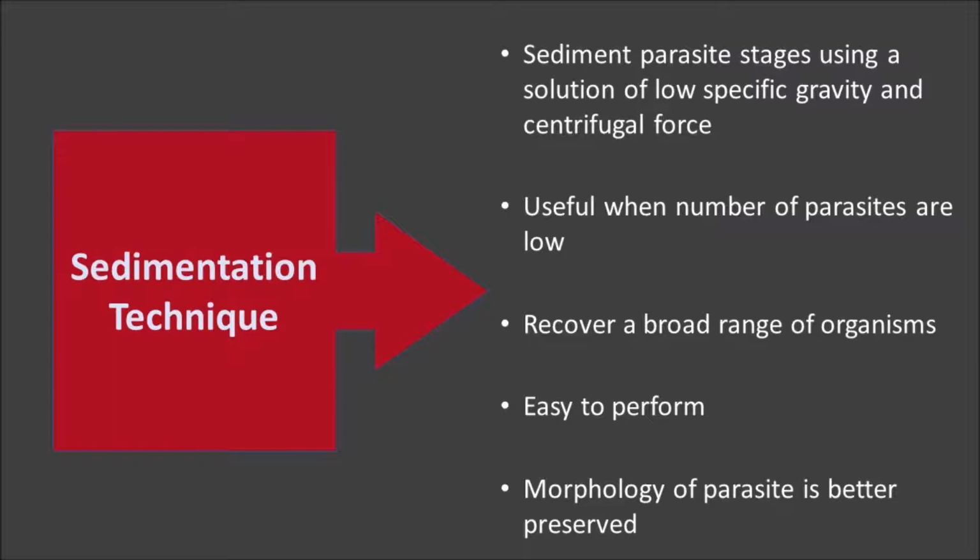Sedimentation is useful when cysts and ova are too low to be detected using a direct smear. Sedimentation procedure allows recovery of a large range of organisms, including protozoan cysts, oocysts, spores, eggs, and larvae.